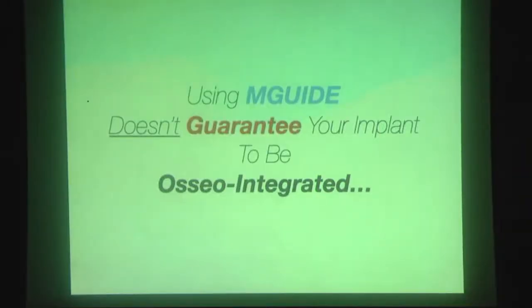Another point, using M-guide doesn't guarantee your implant to be osseointegrated. I mean, for whichever reason you lose an implant in a conventional method, in a freehand surgery, you have the same possibility to lose the implant in the same way. For example, if you lose an implant due to having an infection, you may face the same problem. So you cannot tell me, I used the M-guide, you did your best, perfect, but I lost my implant. Yes, you can. I lost implants also. So it is very, very normal.